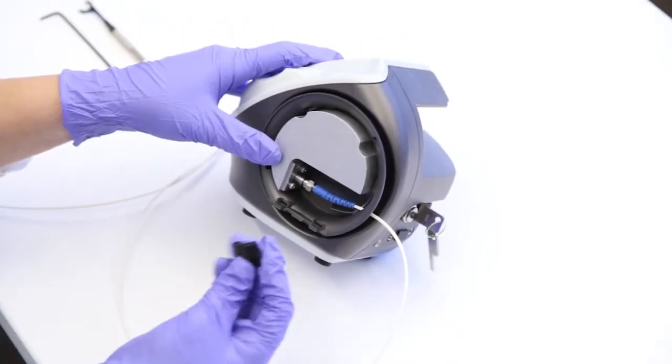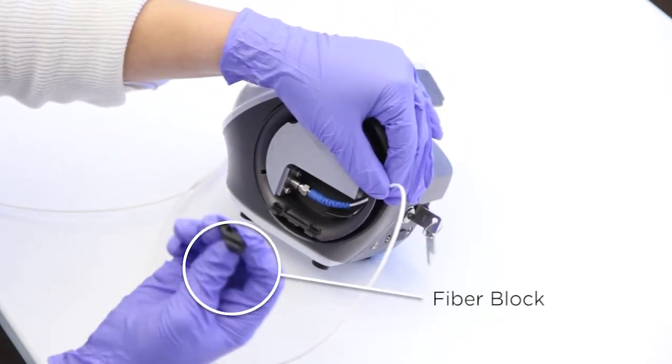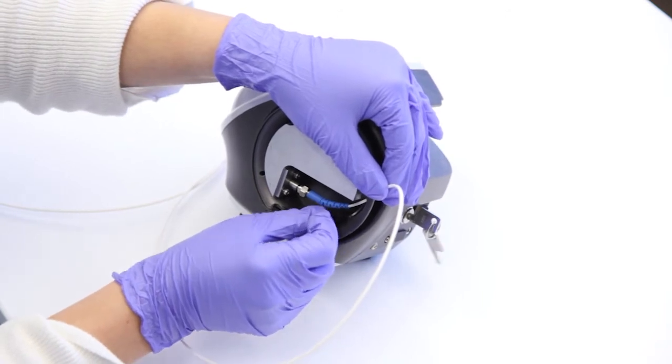Once installed, gently lift the fiber strain relief and carefully slide the fiber block back into place between the fiber strain relief and onto the fiber guide ramp holding up the fiber.